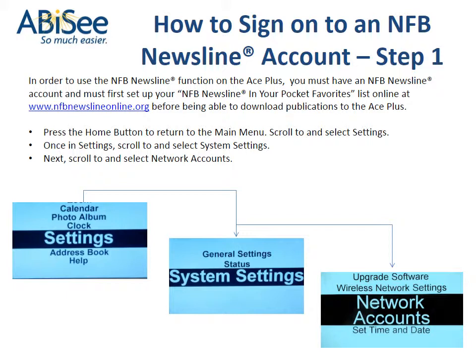Press the Home button to return to the main menu. Scroll to and select Settings. Once in Settings, scroll to and select System Settings. Next, scroll to and select Network Accounts.